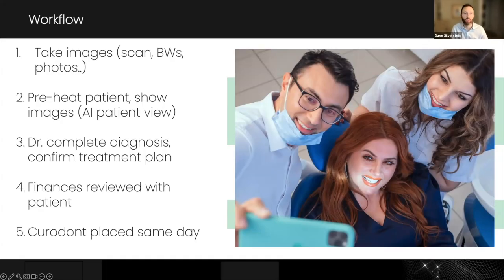So we'll take images, we'll preheat the patient with the hygienist, we'll help the patient understand what's going on. Then I'll come in, I'll confirm the diagnosis, and we'll make a treatment plan. In my office, we always review all treatment finances and insurance coverages or negotiated rates, what the patient's portion will be before we complete any treatment. And then, Curodont is placed the same day.